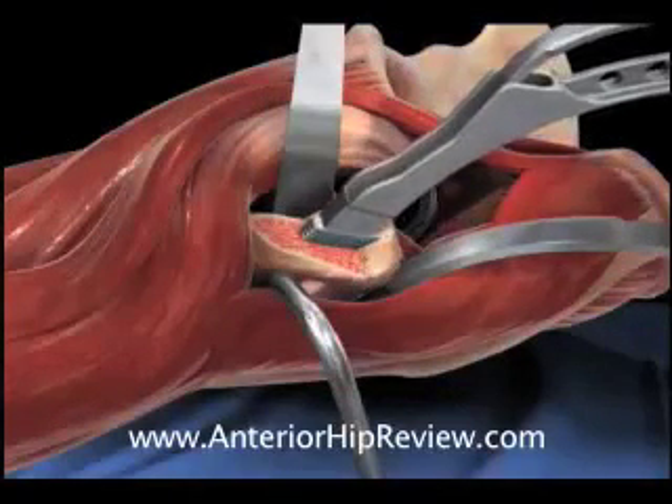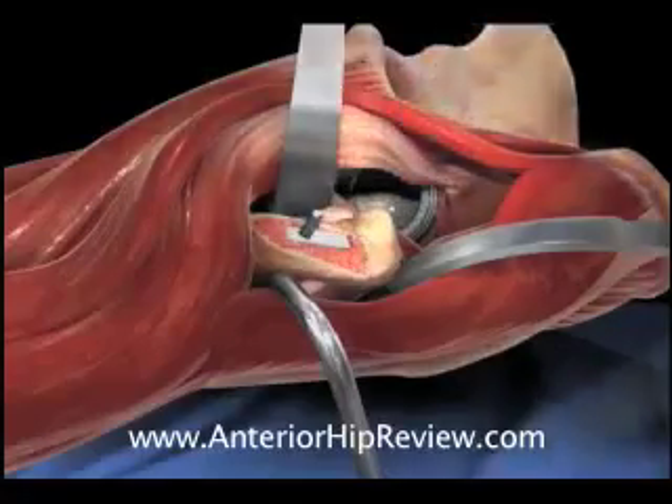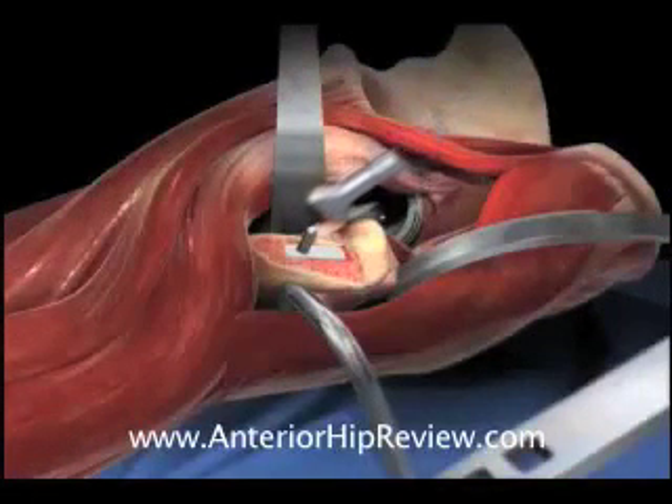Once the final broach is in place, trial components are assembled on top of the femoral broach, and the hip is put back in the socket — a process that we call reduction — in order to trial the fit of the components.